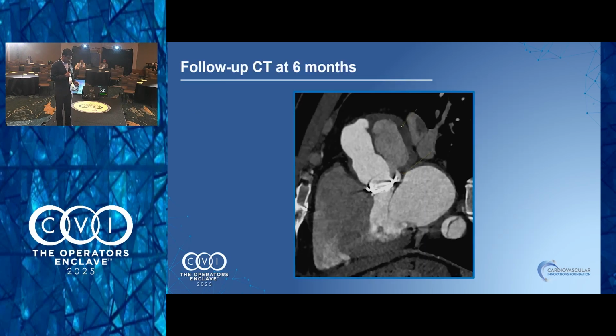Can I see that CT one more time? Yes. So where do you think the entry point is? It's basically just posterior to the valve, but it is a very small neck. That's why I scanned the CT everywhere, whichever way possible, but we just see something next to the valve, and then you see a big sac.